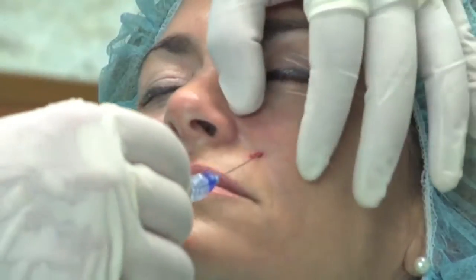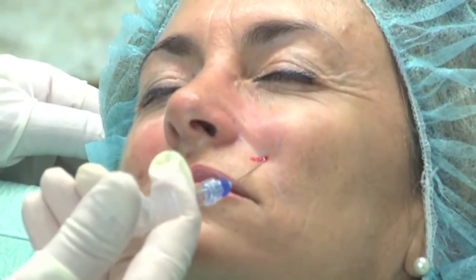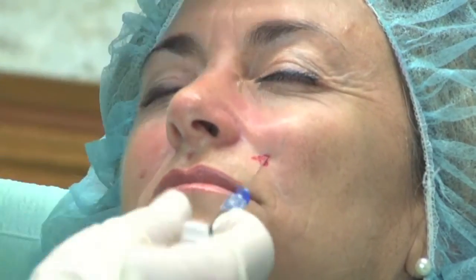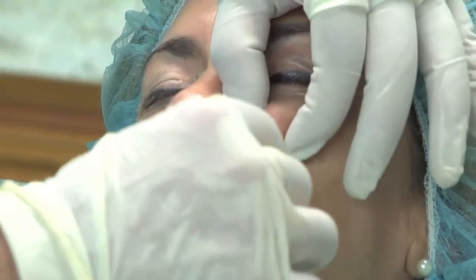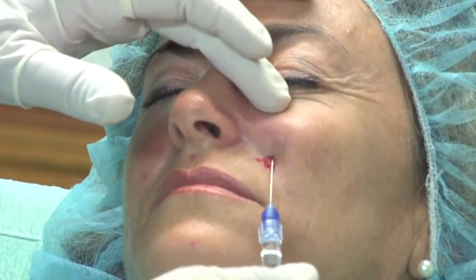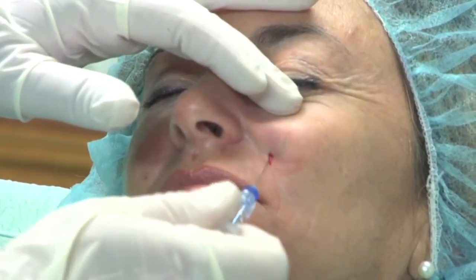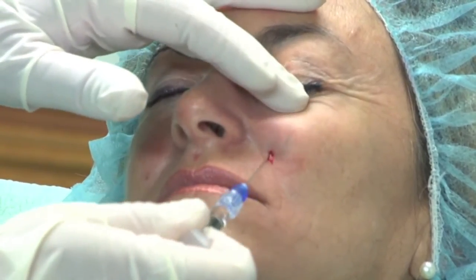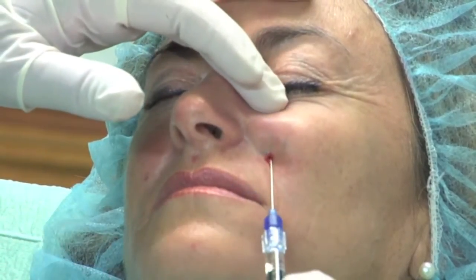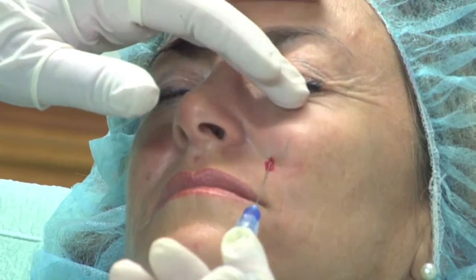the retroceptal fat pad. In this patient example, the cannula is placed through the Nasolabial Port and passed deep to volumize the deep medial cheek fat compartment. The aesthetic goal is restoration of anterior cheek projection and restoring medial mid-facial support. Fat or commercially available filler with large particle size, higher G', and increased cohesivity are recommended.